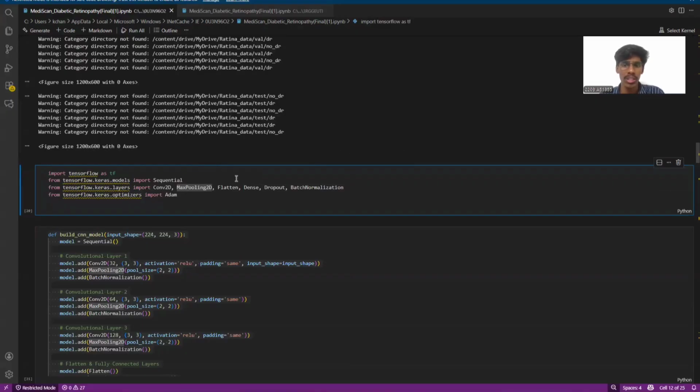This code imports the essential building blocks needed to construct the architecture of your neural network. It brings in the specific layers for processing images, tools to prevent overfitting, and the optimizer algorithm used to train the model.